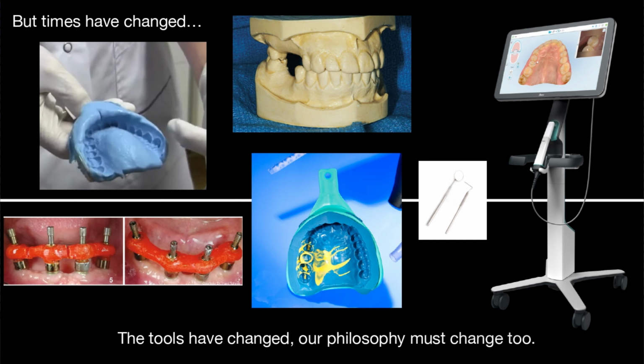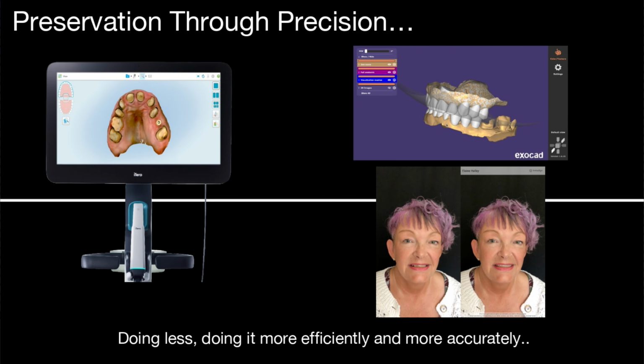And again, even over the course of my 30 plus years in dentistry, we have changed hugely the techniques that we're able to use. The technology is coming in leaps and bounds. I don't need to explain that to this audience, but our philosophy has also changed. We're trying to be minimally invasive. We're trying to hold on to tooth structure. We can be really sophisticated with our planning. We can visualize everything that is possible. We can create avatars of our patients and let them see what's possible.